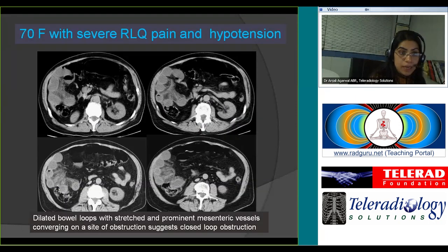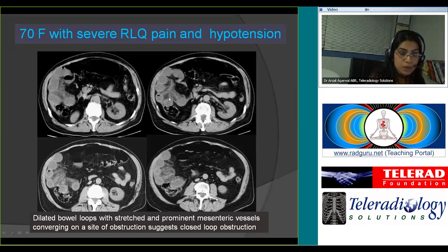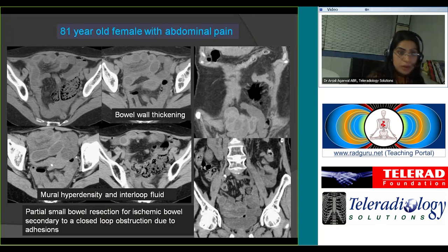This elderly female presented with severe right lower quadrant pain and was hypotensive. Notice a cluster of dilated small bowel loops in the right mid-abdomen with prominent mesenteric vessels that are almost getting stretched, and fat stranding in the mesentery. The other bowel loops proximal and distal look fairly normal. This is a case of closed-loop obstruction where the bowel loops converge on a site of obstruction — the point where the twist is happening.